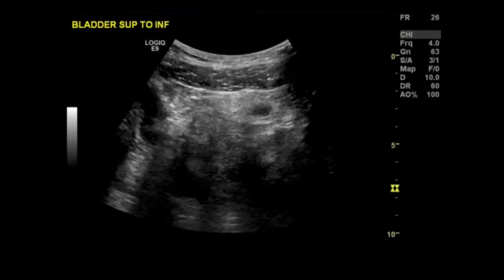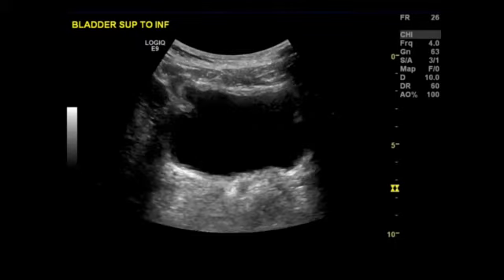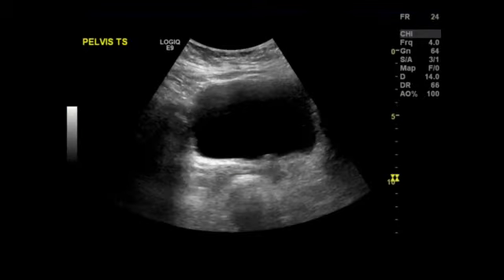So here's that same bladder that we talked about, the ridge in the top of it, going from top to bottom in transverse section. Here are the ureteric orifices here and here, and as we fan down through to the prostate and down through the bottom, there is a ureteric jet, the patient's left and now the patient's right. Here's another one, a nice bladder in transverse section.